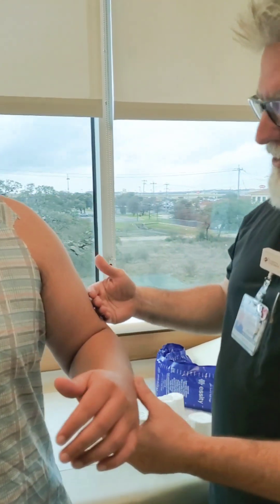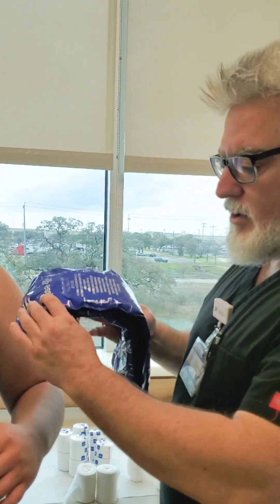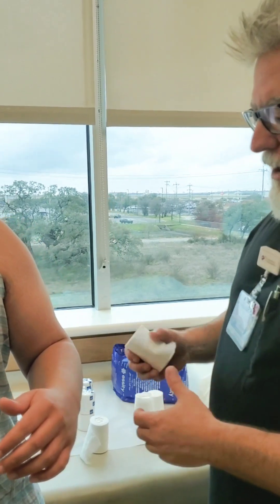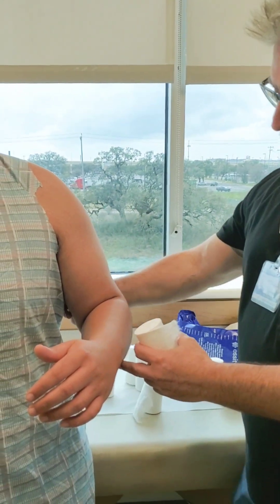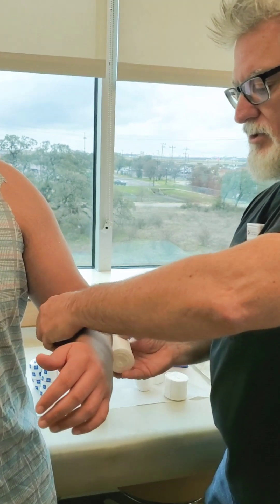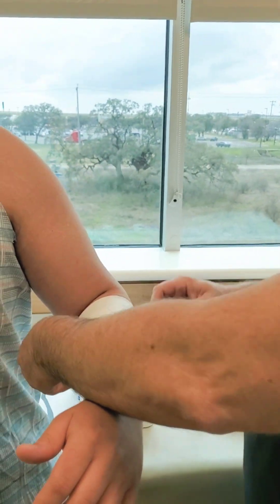In this case we're going to assume he's got a fracture. We're going to use standard cotton padding, and instead of plaster — because plaster is messy — we're going to use ortho glass and some regular straps. I'll start mid-forearm on purpose, because the coaptation splint will only come just under the elbow, so it won't go any farther than my middle finger. I start the padding just distal to that so we have extra padding there.